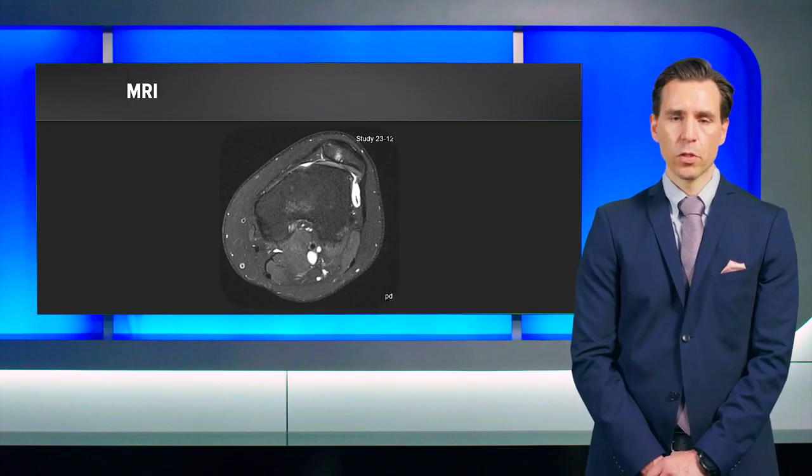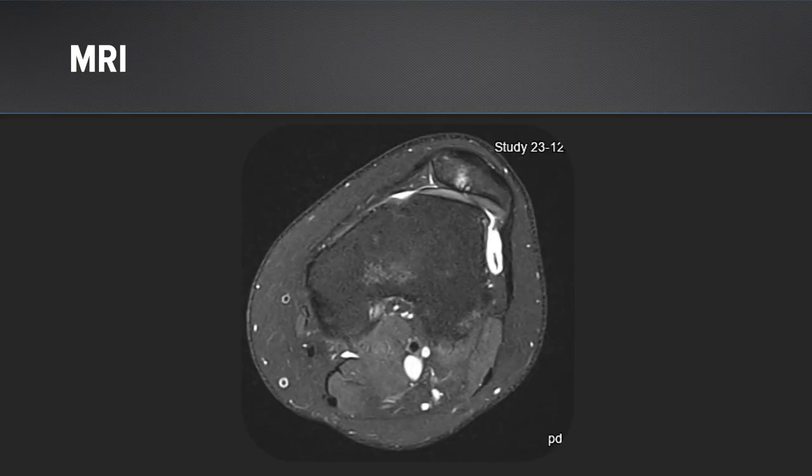On axial views on her MRI, we clearly saw this trochlear dysplasia with a cliff sign and a more or less convex configuration of the trochlea, meaning a trochlear dysplasia type D, plus a lateralized patella, plus a full thickness cartilage defect, partially also touching the subchondral bone, on the center of her kneecap.